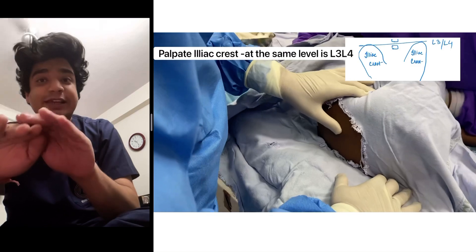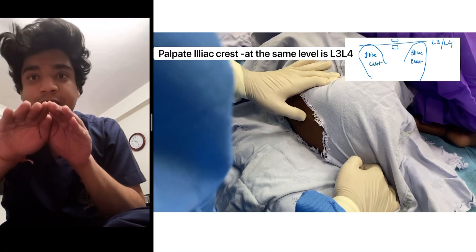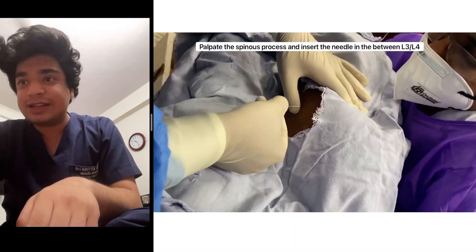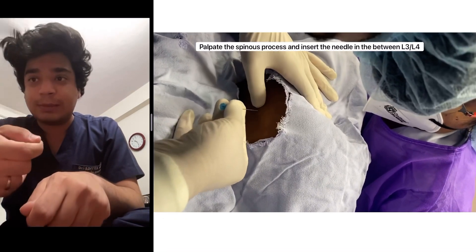At the level of the iliac crest is the L3-L4 vertebra. We know the spinal cord ends at L1, so we will be doing the lumbar puncture at L3-L4. I am palpating the spinous process, and in between the spinous processes I will be inserting my needle for the lumbar puncture.